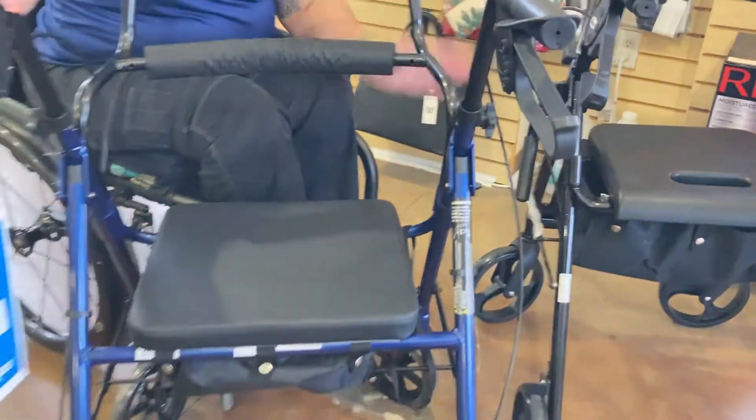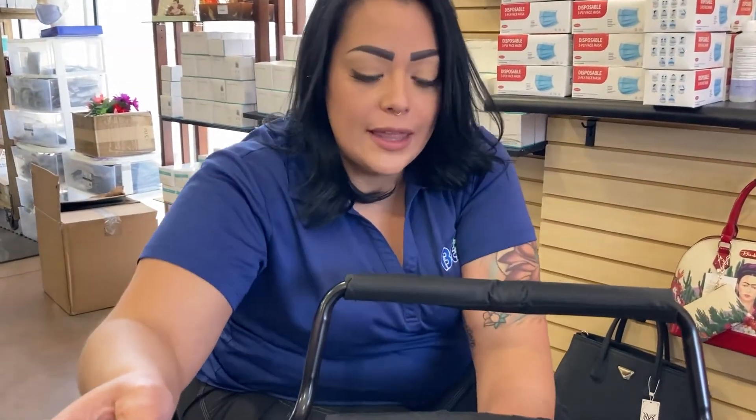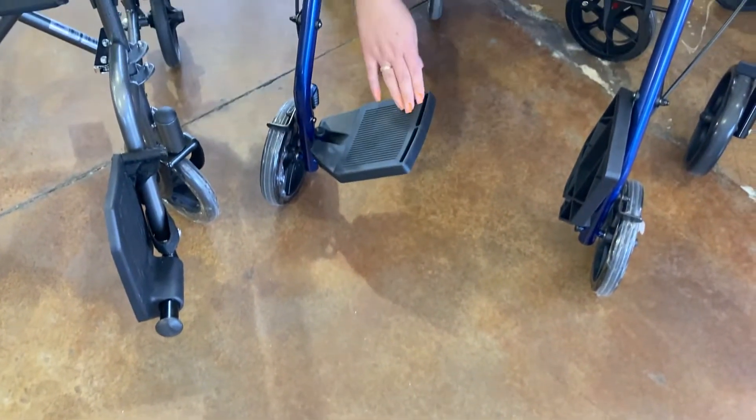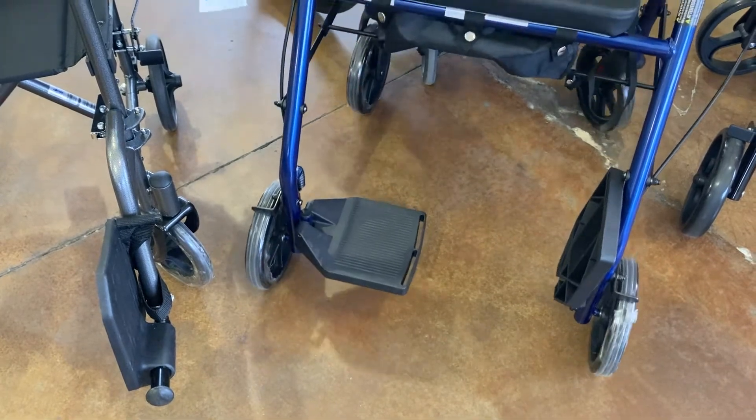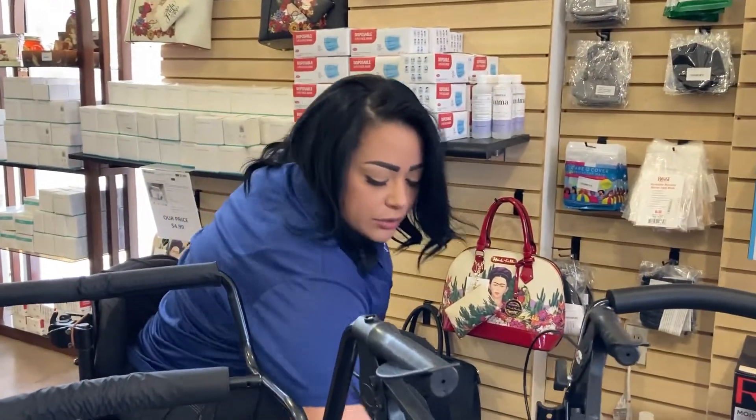So you're going to be using it as a rollator with the brakes and the seat, but if it gets to a point where just resting is not going to cut it and you need a little bit more help, this has a foot rest. So this is going to give you the option to sit completely and then someone will be pushing you around.